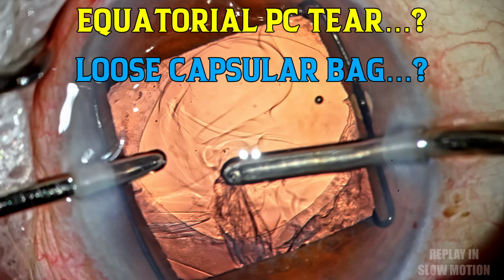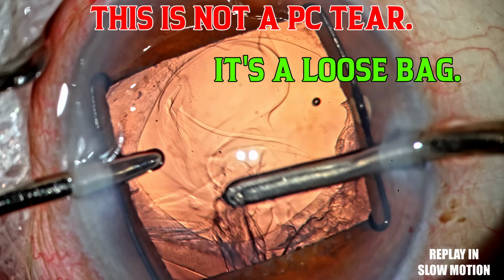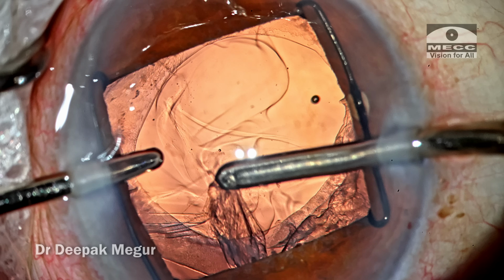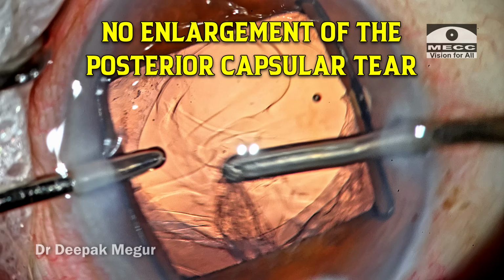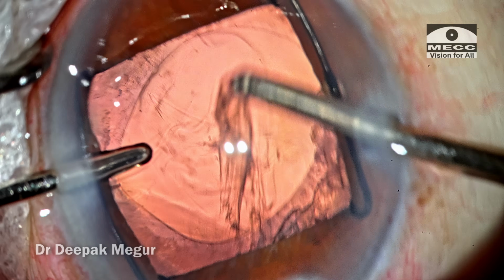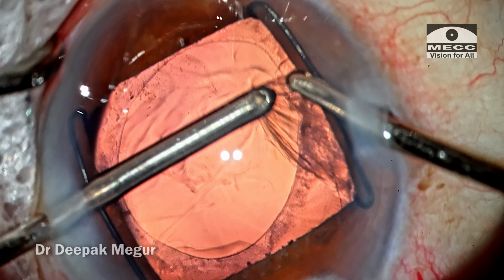Now, how to differentiate? So this is a replay. Well, I convinced myself that this is not a PC tear and it is just the loose bag trying to come along, because of the lax zonules. The reason why I ruled out PC tear was I wasn't seeing any demarcation line, and secondly, if there was a PC tear with the irrigation being continuously on, I would expect it to enlarge a little bit, and there was none of this. So at this point I convinced myself that it is not a posterior capsule tear. The remaining cortex again is gently peeled out.